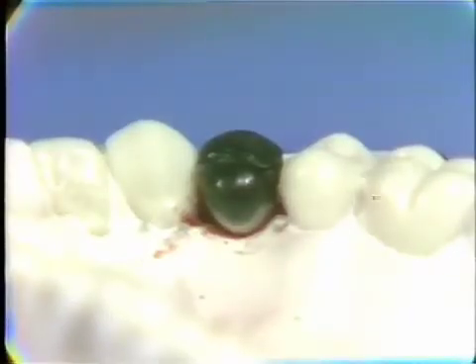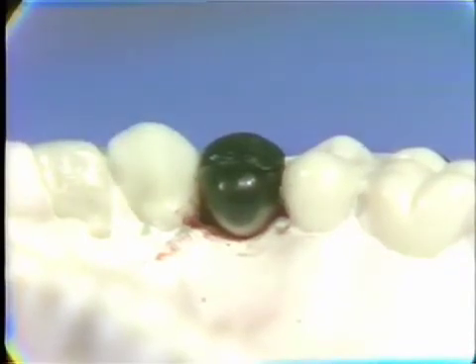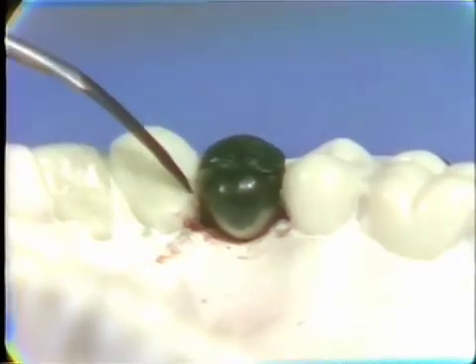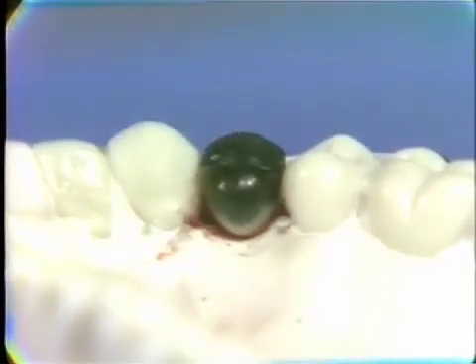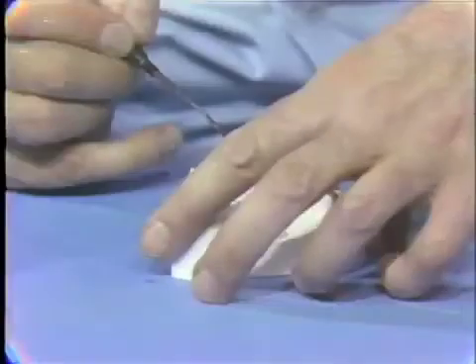The waxing of the occlusal surface is now being completed, and I think you can see, looking from the lingual as you have it on the screen, how it comes out into proximal and runs down, covers over the keyway there, and sweeps up again into the other embrasure there. You can see the development of the occlusal embrasures on the mesial and distal with the correct marginal ridge relationship.